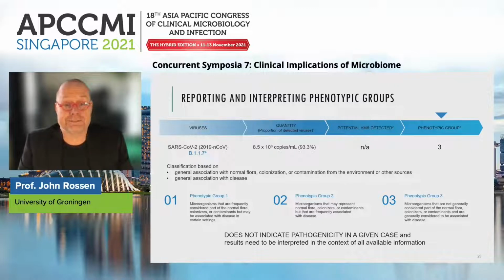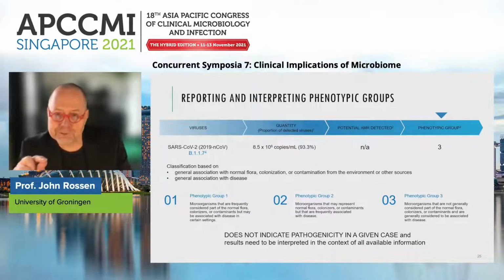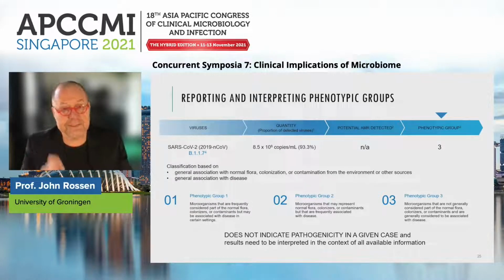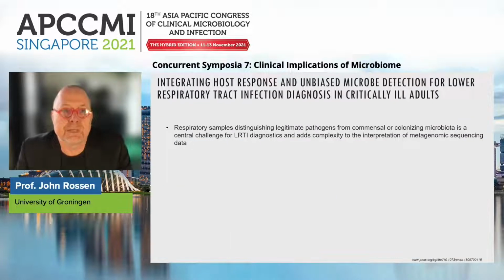Another interesting thing is that, and I have to stress before I continue, obviously this phenotypic group does not indicate pathogenicity in any case. And of course, the results need to be interpreted in the context of all the other available information.